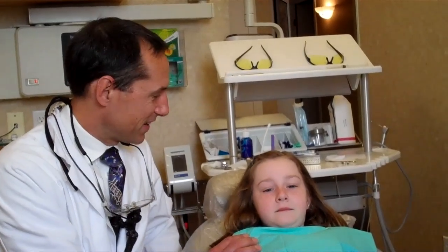Hi, this is Dr. Anilak from TheGentleDentist.com in Shelby Township, Michigan. Today we have a very fine young lady right here — Heather is going to let us record a procedure we're going to do on her. That procedure addresses an issue that sometimes young children have when their teeth start coming in and they have an additional muscle fiber called a frenum.